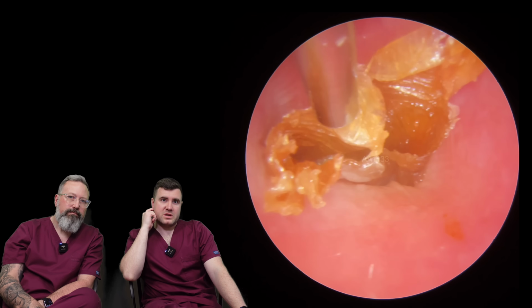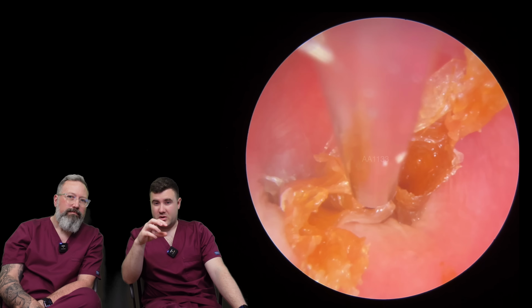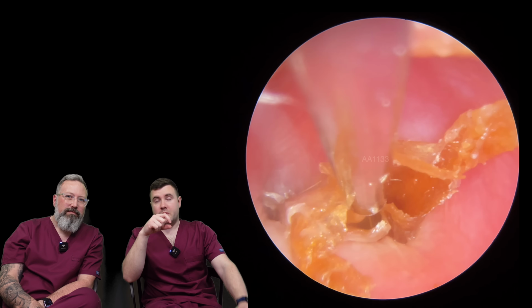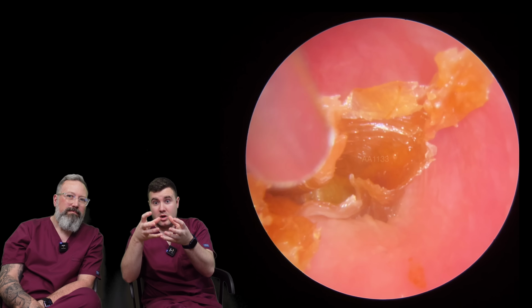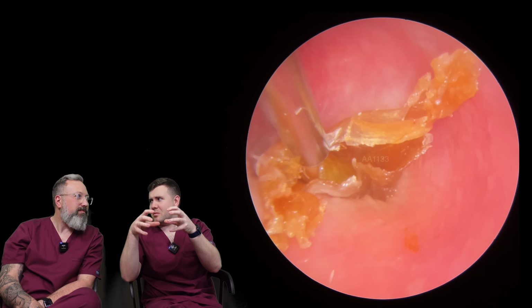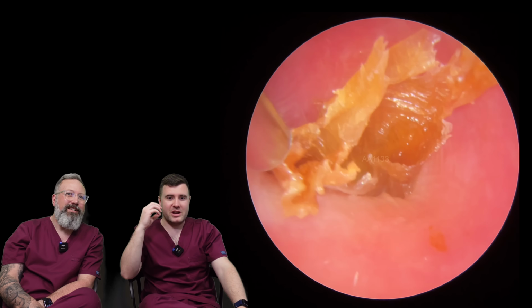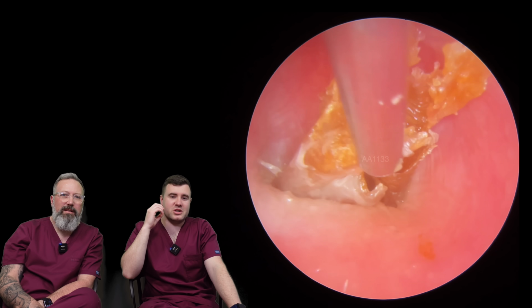The way the patient was explaining it, because this is obviously attached to the eardrum, we've got to try and pull this gently to peel it away. The way the patient was describing it is as that pulling sensation. When we're pulling on that skin, he actually said his hearing felt like it was getting worse, not getting worse, but because of the pull from the skin, it just felt really strange for him. Deadens the sound, I'd imagine. Yeah, so that's why there were little flinches here and there.